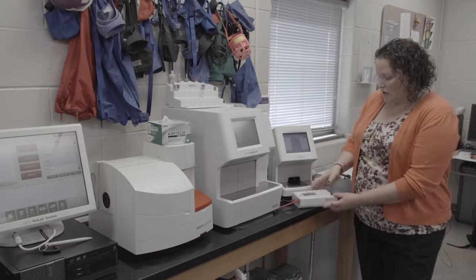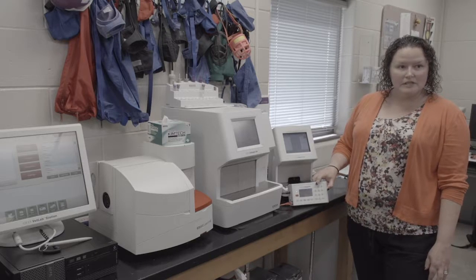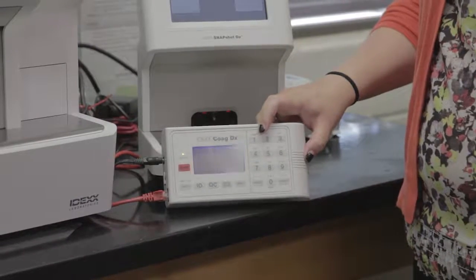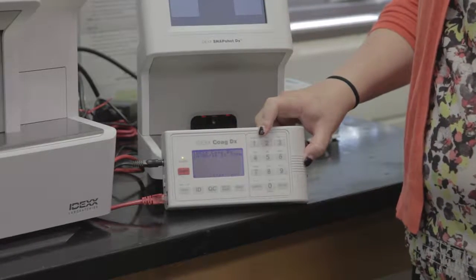Down here we have our COAG, IDEXX COAG. This is what will run your clotting tests, so your PT and your PTT. It runs on sodium citrate cartridges, and it would run off of a blue top tube.